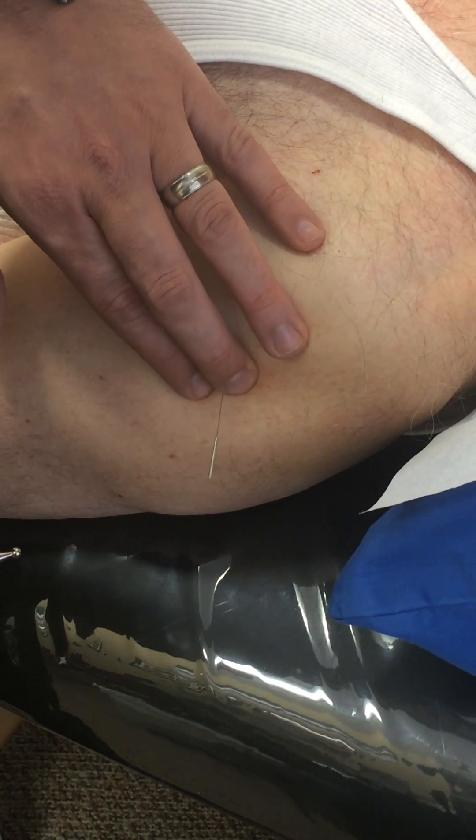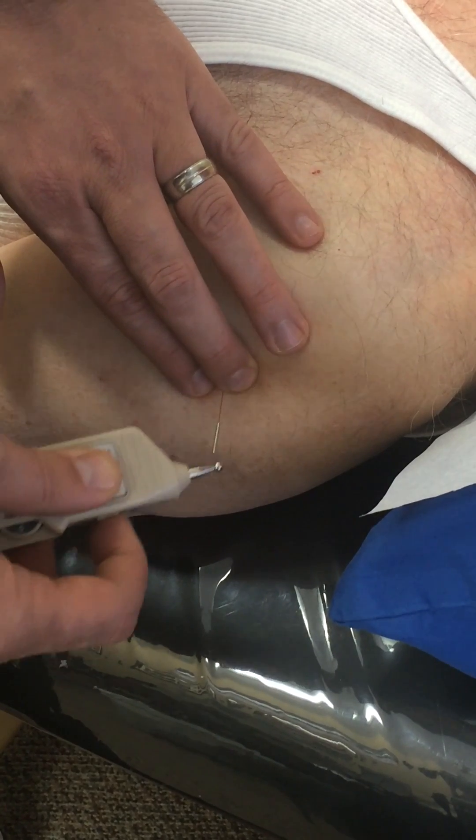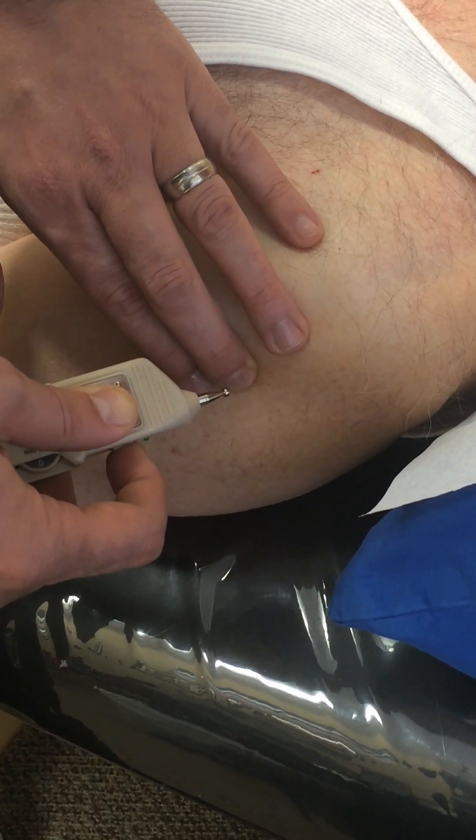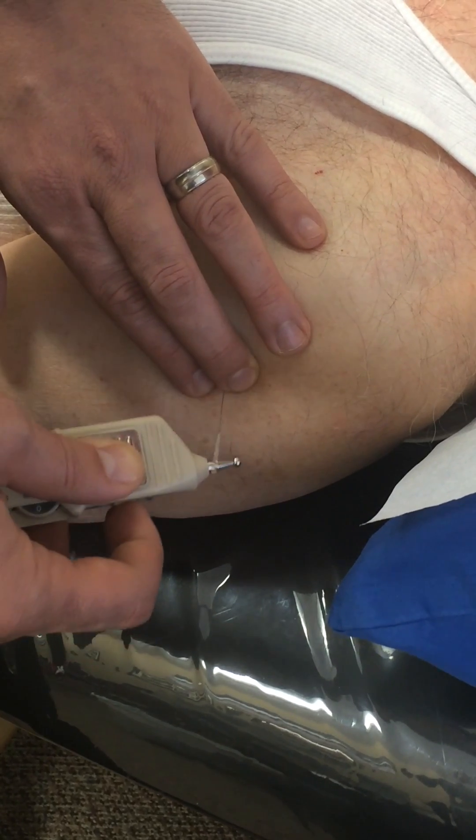I depress my hand like this. This is the position, and at the same time I press the button, and you can see we get the contraction of the deltoid.